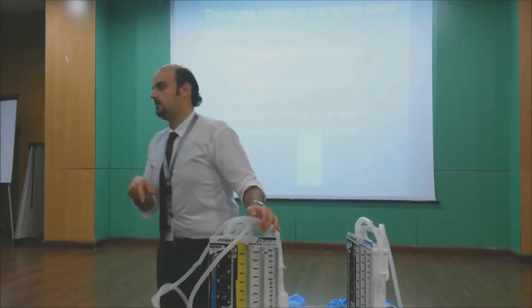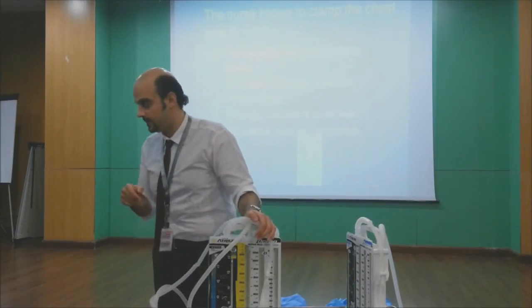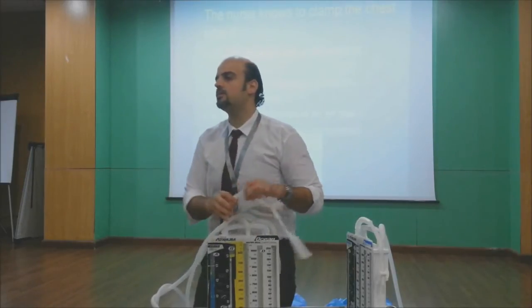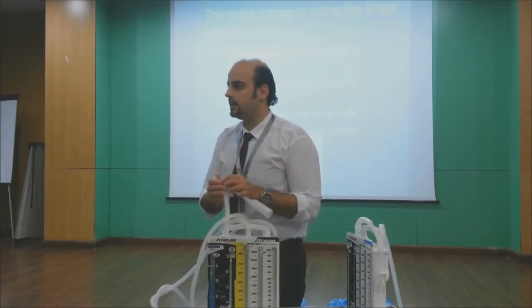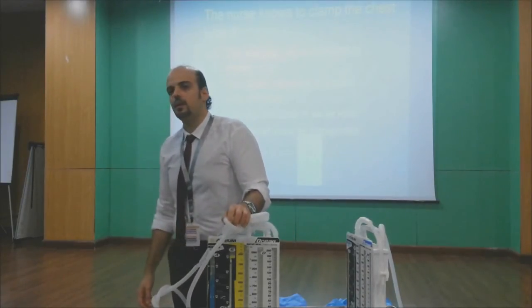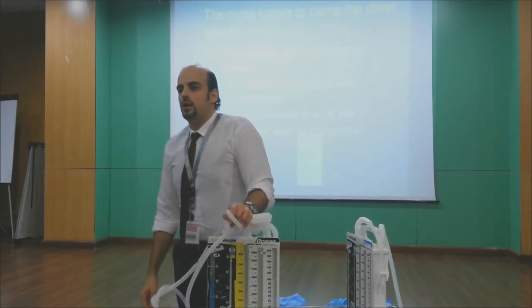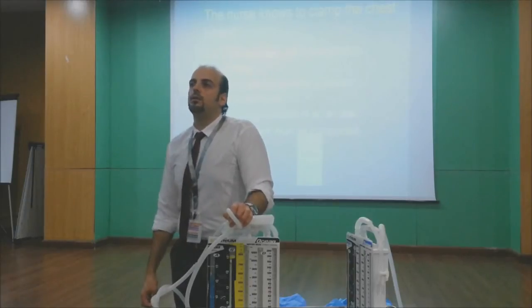Disadvantage of this? Maybe a source of infection. After 72 hours, it's an absolute source of infection. We can leave it up to 10 to 15 days, I know, but this is not ideal. But as a prophylaxis, this is a good question. So, is it worth it? Yeah, it's worth a lot. Why? I will tell you.